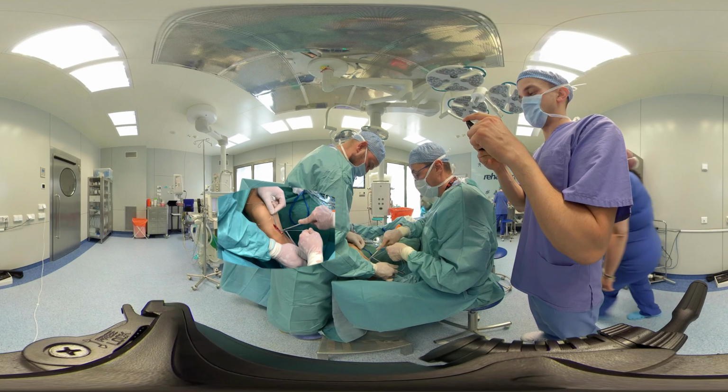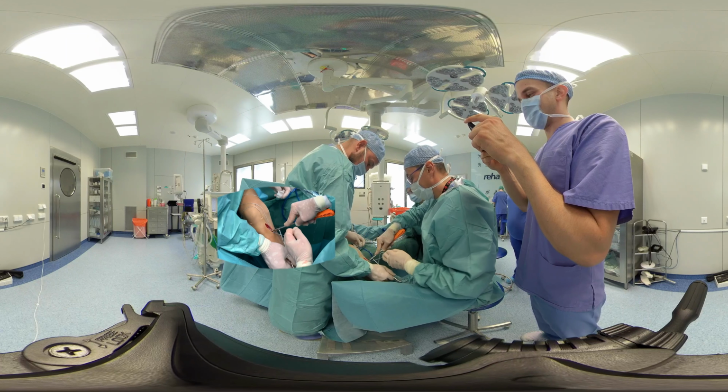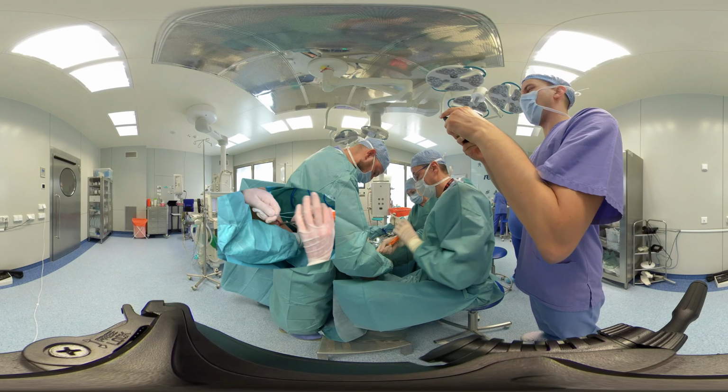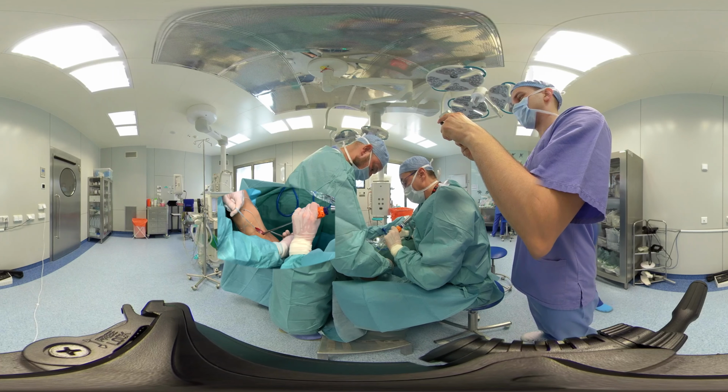We put on the footprint according to the technique. First, prepare the appropriate hole, then tap the anchors, keeping the tension. Tapes screw into the internal part of the anchor.